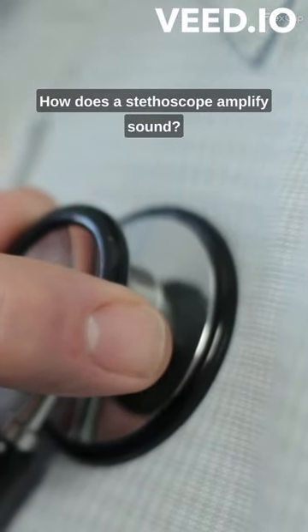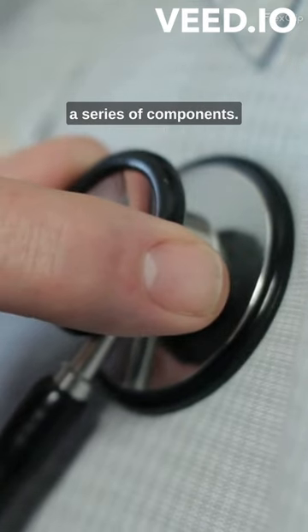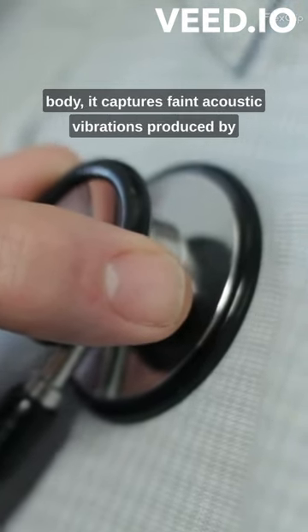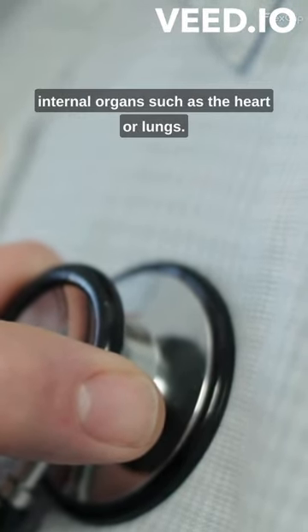How does a stethoscope amplify sound? A stethoscope amplifies sound through a series of components. When the chest piece is placed on the body, it captures faint acoustic vibrations produced by internal organs, such as the heart or lungs.